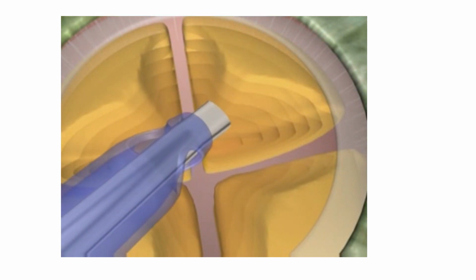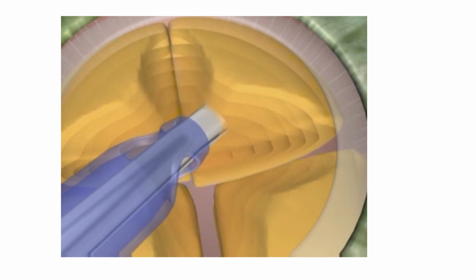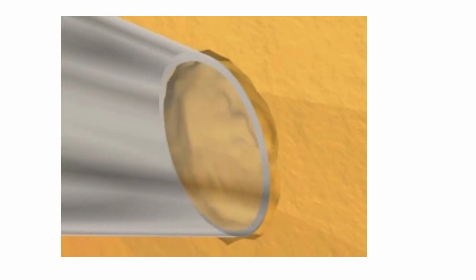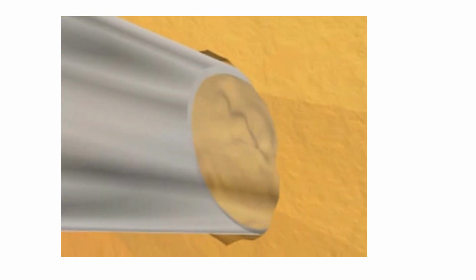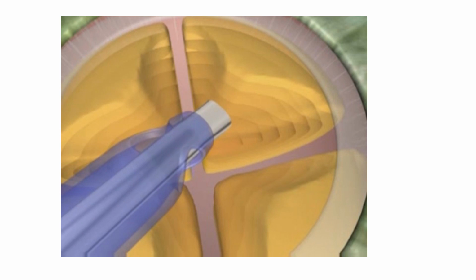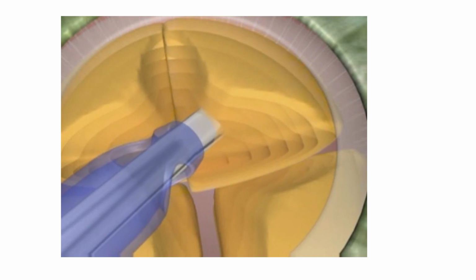At this point, you may think, if increasing stroke length will help us to have more punch power inside the eye, why not always use the highest stroke length? We should always use the highest stroke length because that will break the nucleus, right? But that is not easy. Because remember, in phacoemulsification, we need to satisfy the three principles of phaco, and I covered that in part 1.